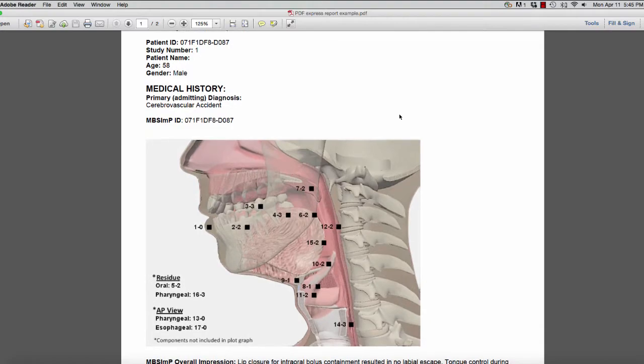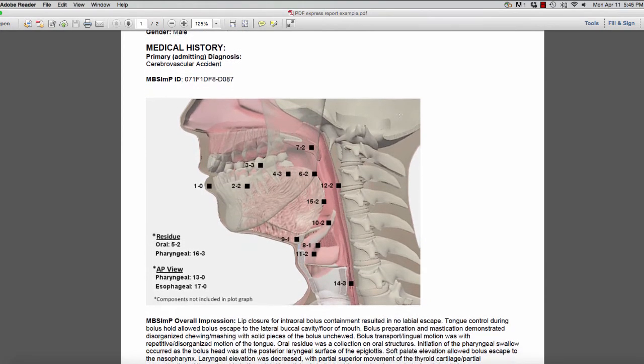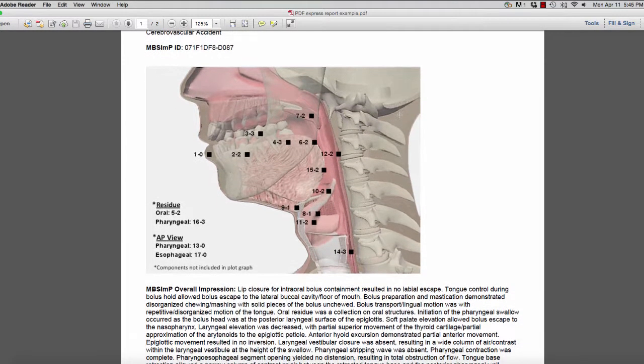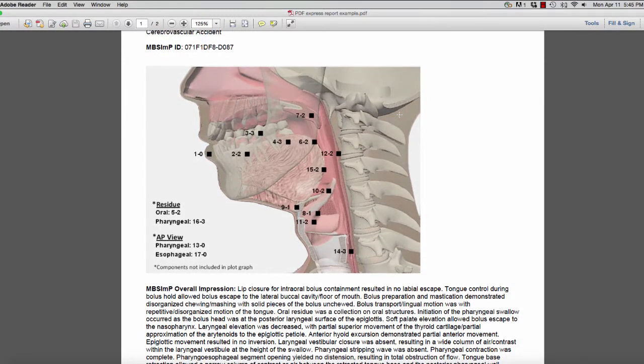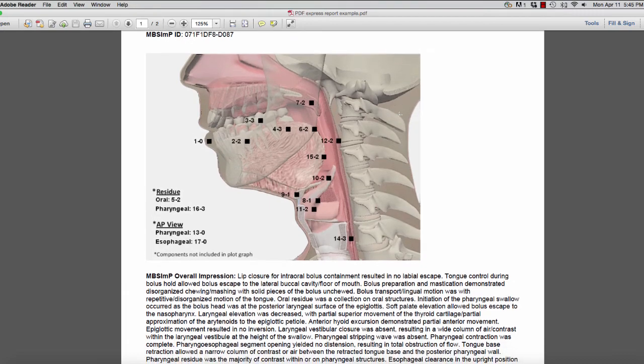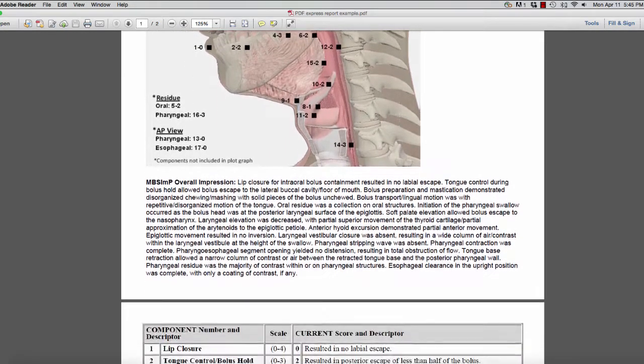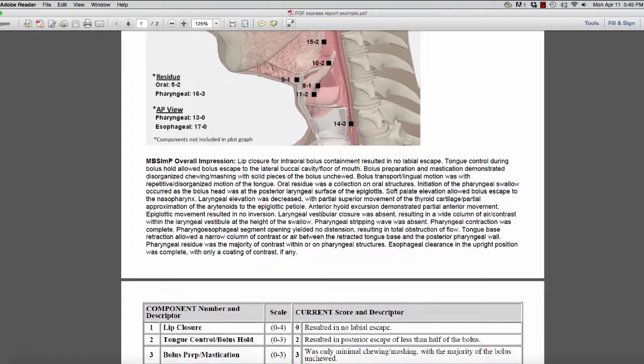Scrolling through the report, you will notice that there is a plot graph image representing the location and severity of each of the 17 MBS IMP physiologic components. The plot graph image is a feature of both the full and express report generators.